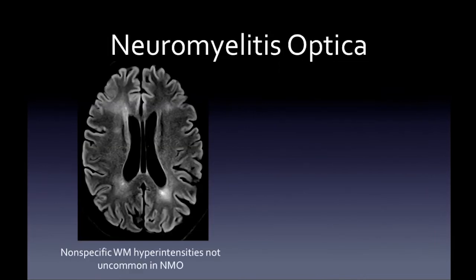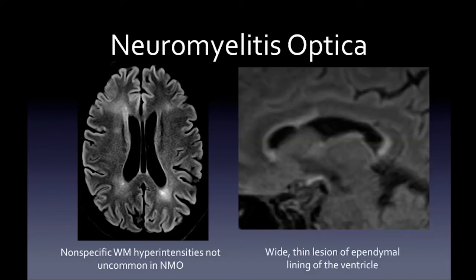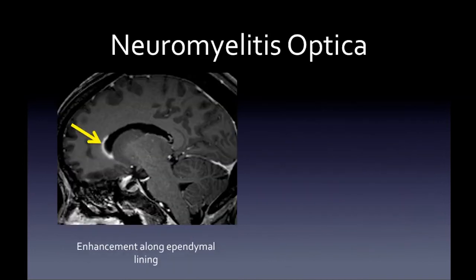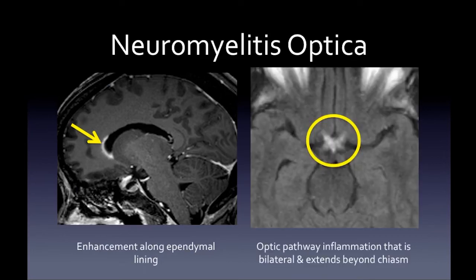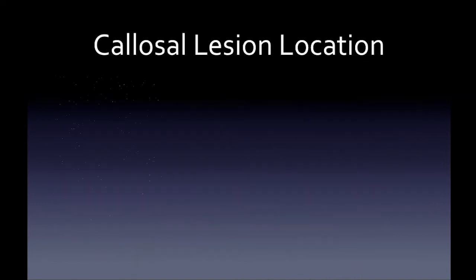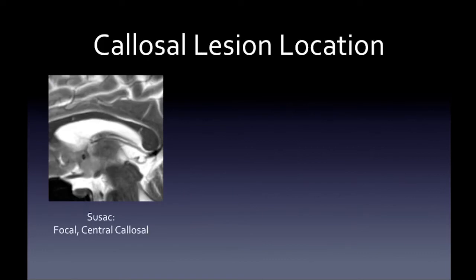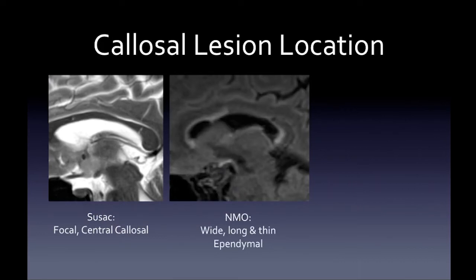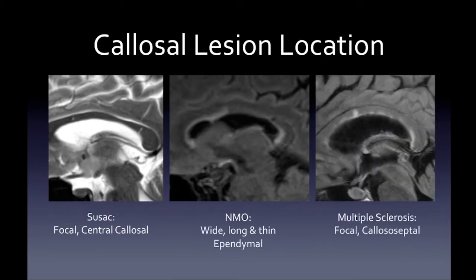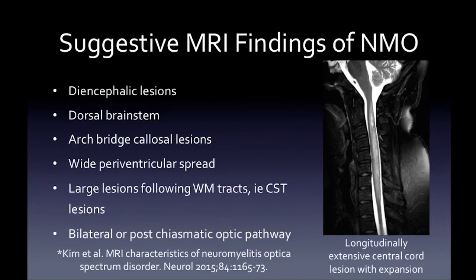In NMO, there can be nonspecific white matter hyperintensities. On the corpus callosum, NMO lesions are wide and thin along the ependymal lining of the ventricle, as opposed to the focal lesions at the callosal-septal interface seen in MS. Here is a case showing enhancement along the ependymal lining, and another case of chiasmatic or post-chiasmatic bilateral optic pathway neuritis — more suggestive of NMO. Compare callosal lesion location: Susac = focal central callosal; NMO = wide, long, thin ependymal lesions; MS = focal callosal-septal interface.